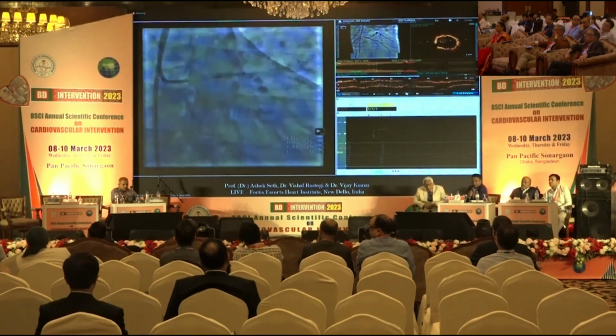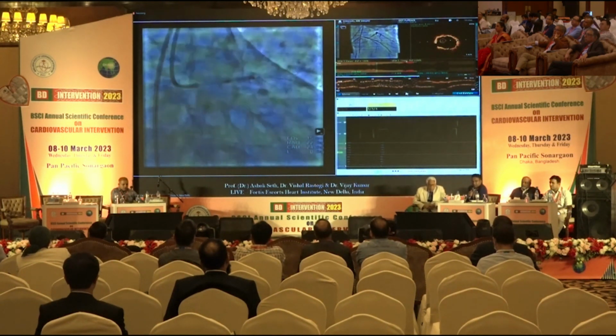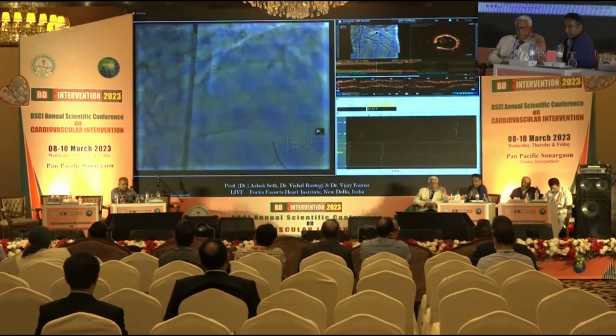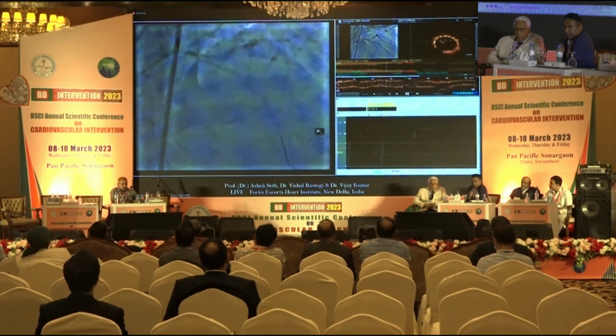It is always important to look at the IVL balloon in 2 orthogonal projections to understand whether it's expanded or not, and it's not in this view. So we delivered all 80 pulses here. And you can see in the cranial view it looks expanded.